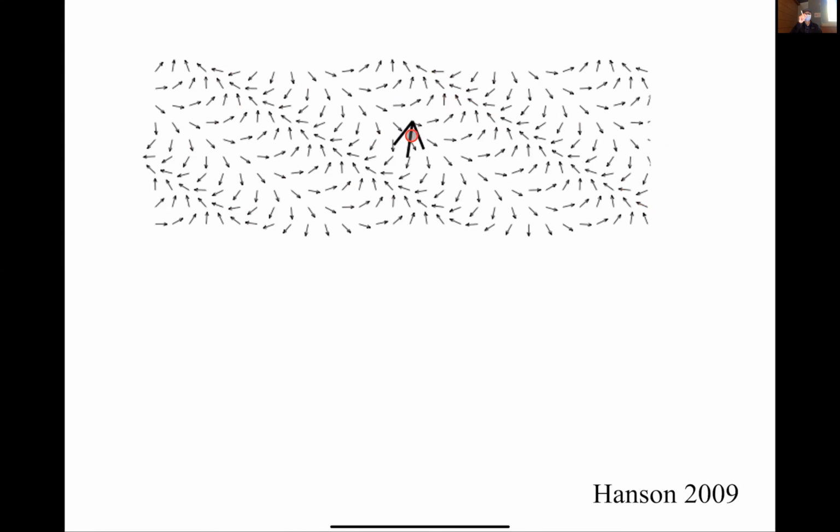So that's a complex number, and I would take that complex number, the real and imaginary part, and put it into someplace in K space. So for example, here in K space, I'm out here, right? This value would just be put into that part of K space. The key is that it looks like a fairly small arrow, right? Things canceled out.